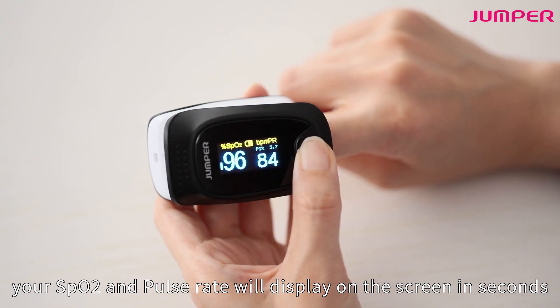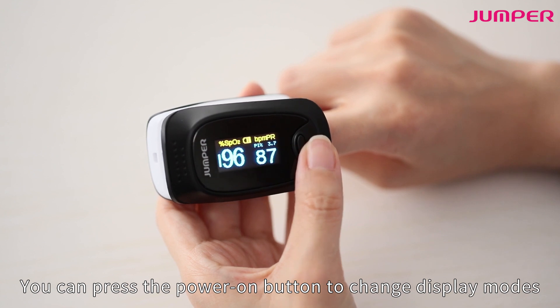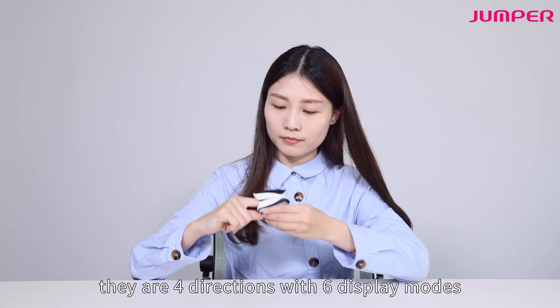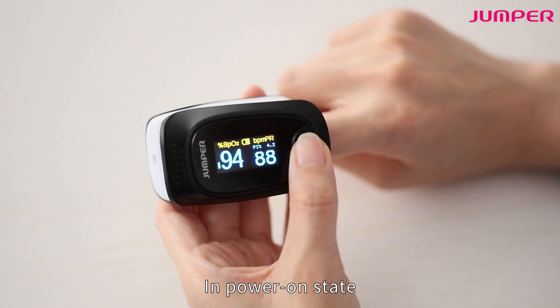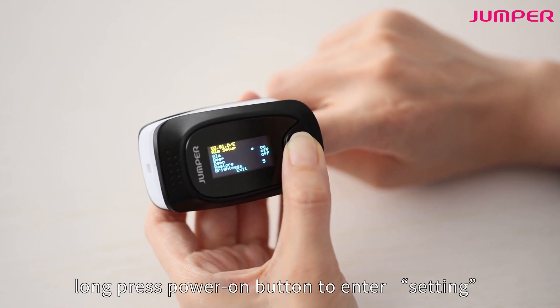You can press the power on button to change display modes. There are four directions with six display modes. In the power on state, long press the power on button to enter settings.